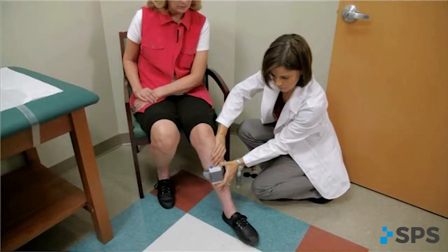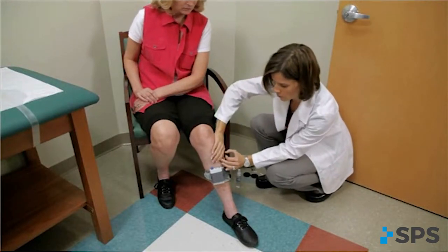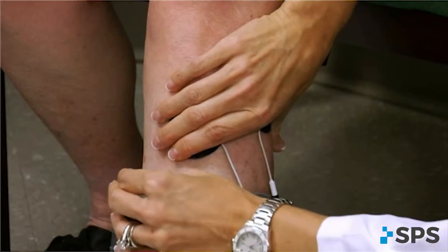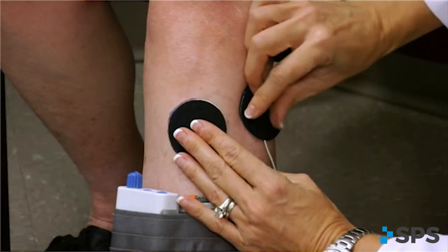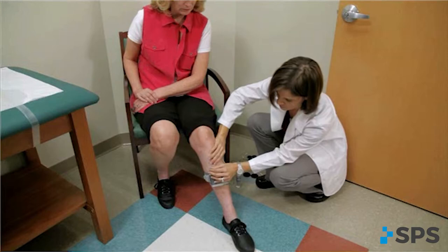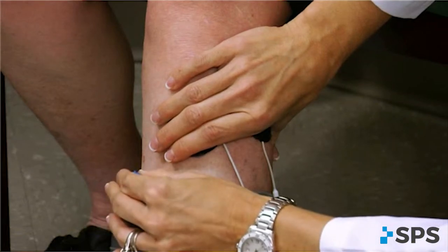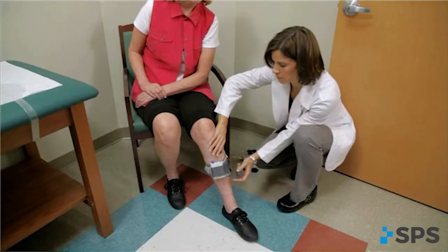If no movement occurs with stimulation, reposition the back electrode to find the motor point. Moving the electrode inferior and/or anterior should elicit more dorsiflexion. Moving the electrode superior and/or posterior should elicit more eversion. Keep in mind that although anatomy is fairly specific, each body is unique. You may need to think outside the box. For example, the motor point that produces a functional foot lift may lie in the popliteal fossa near the lateral hamstring insertion, right along the posterior fibular head, or anteriorly within the tibialis anterior muscle belly.